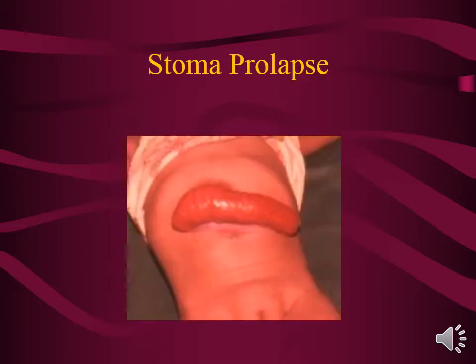This is a stoma prolapse, and you can see that this is a kiddo. It is most common in peds because of the extra abdominal pressure that is placed when they cry. They would be at high risk for a stoma laceration. Again, no nerve endings in that stoma. We have to use larger devices to contain the stoma.